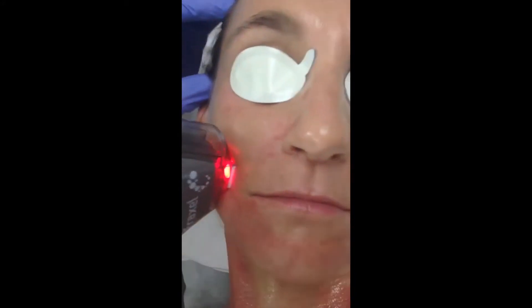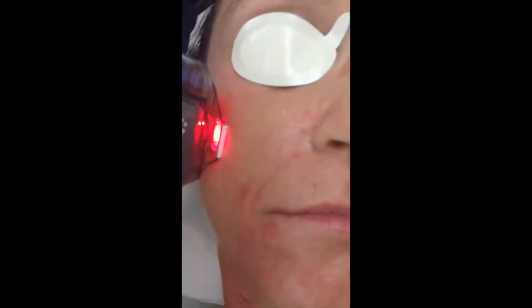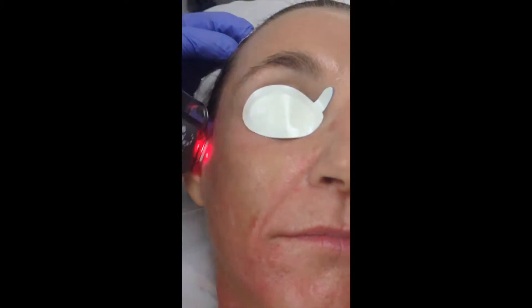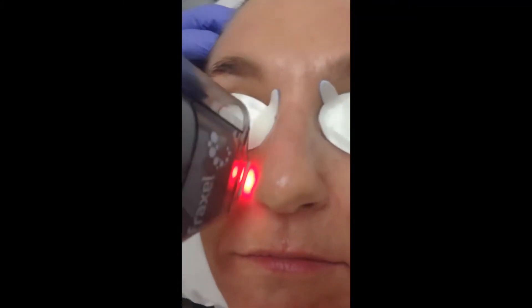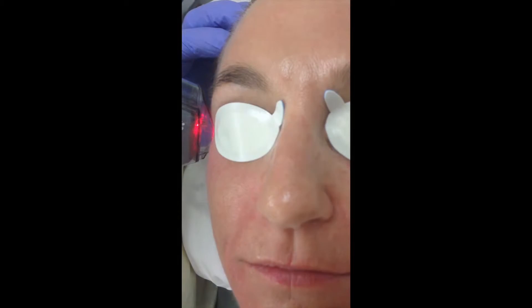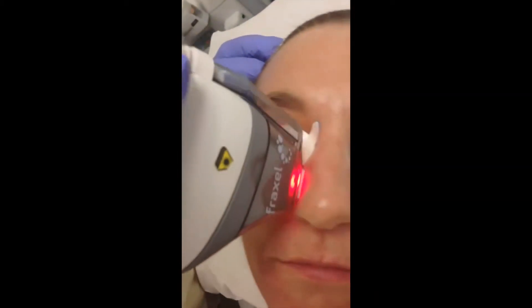We can hear the audible beeping, which tells us how fast or how slowly we're going. If we couldn't hear the audible beep, then we wouldn't know that the device actually worked.